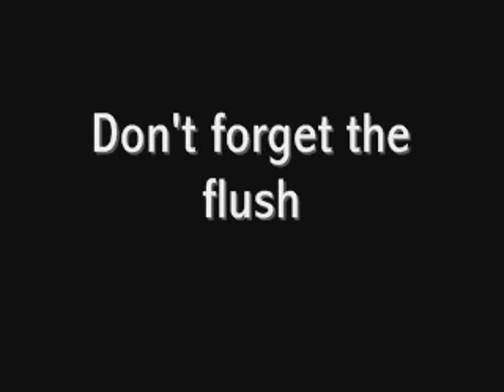Now to wrap things up, here are some pitfalls to avoid with central line placement — rookie mistakes that you'll want to avoid. Number one on the list: don't forget the flush. You have to do it before you get fully sterile. There's nothing worse than getting gloved and gowned up and realizing you have to start over because you didn't put any flush in your kit or in a sterile basin. Don't forget the flush.